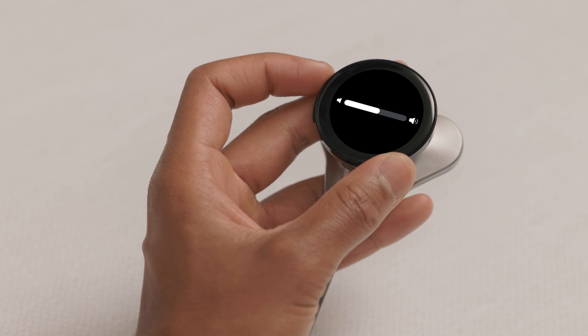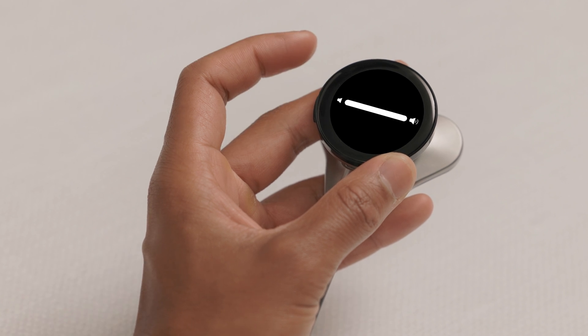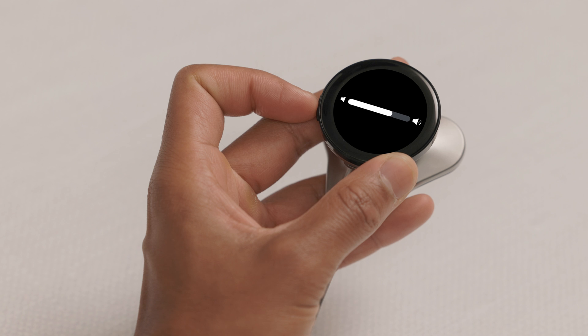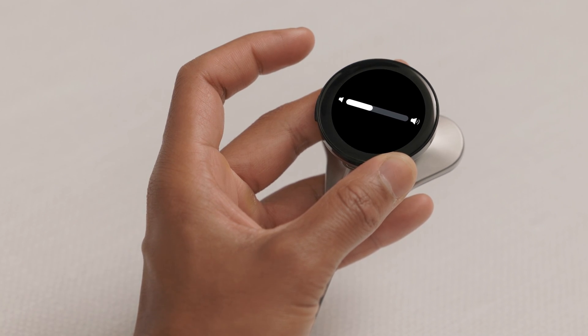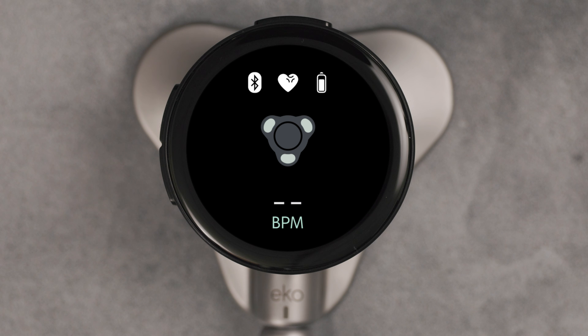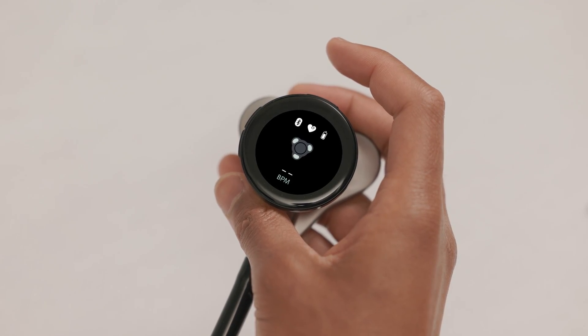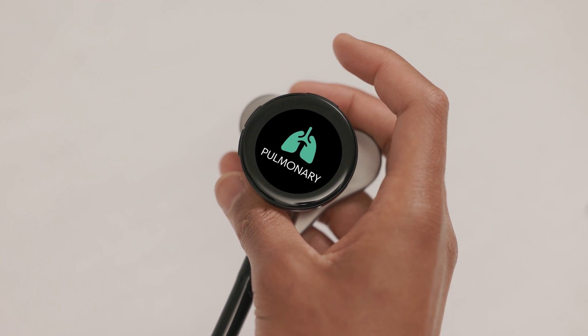To change the volume, press the up or down buttons on the side of the device. Now that your device is on, let's take a tour of the screen. The audio filter shows at the top. To change to a different filter, press the top button for less than one second between each filter. You can choose between cardiac, pulmonary and wide.